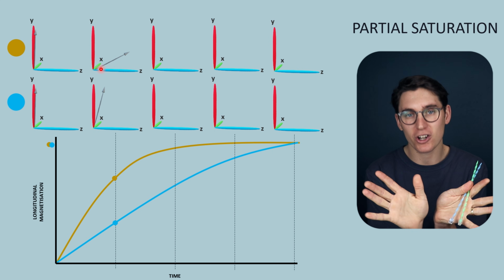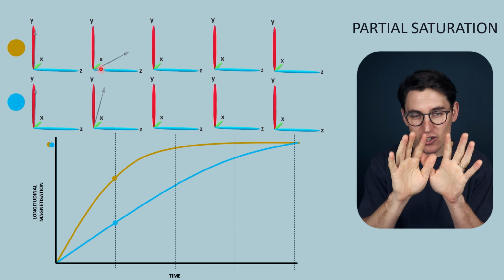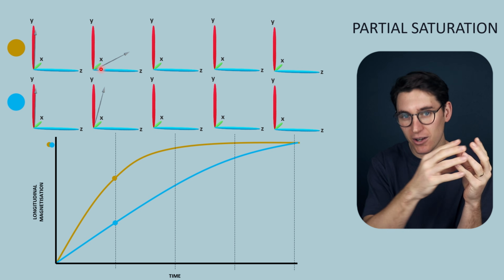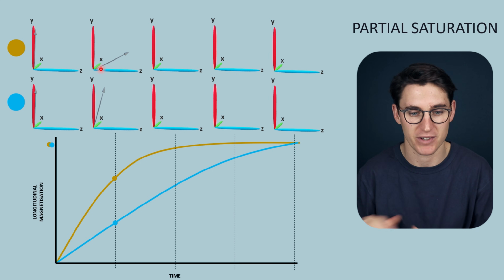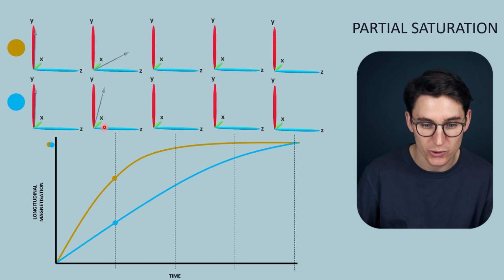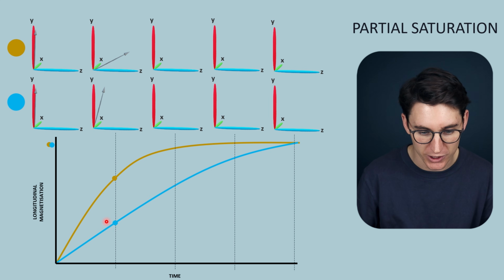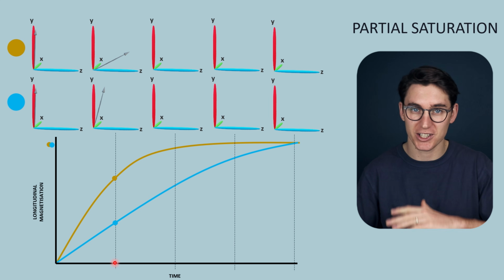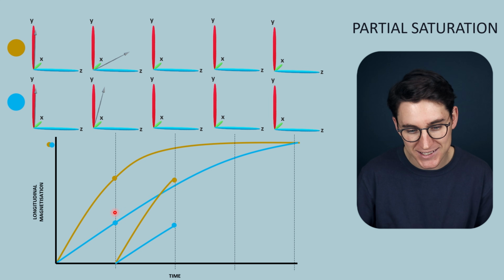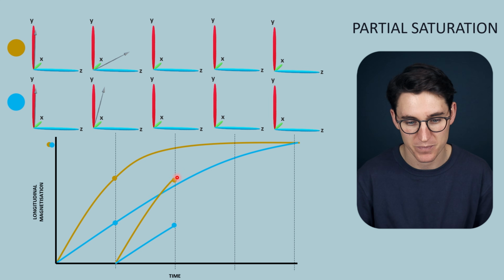We get rapid loss of transverse magnetization with spin-spin interaction, and that transverse magnetization gets lost much before we get recovery of the longitudinal magnetization vector. So these arrows here are only representing the degree of longitudinal magnetization that we're recovering. Again, we lose longitudinal magnetization here because we flipped it to 90 degrees, and then they will recover at the same rate as before, the T1 for those specific tissues.